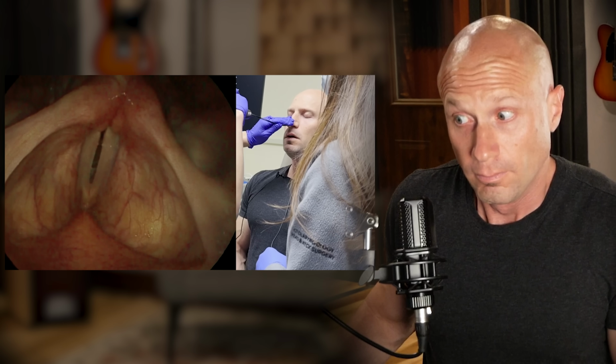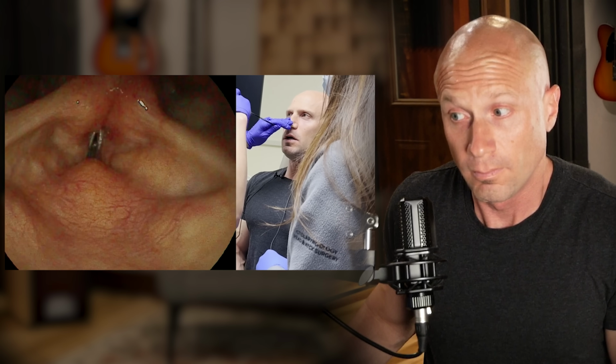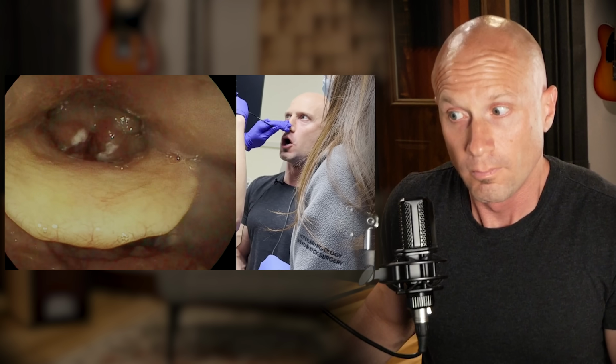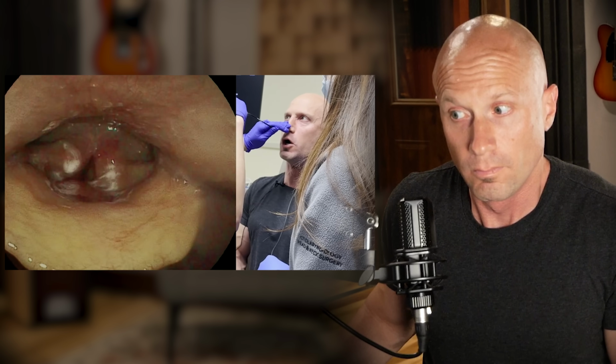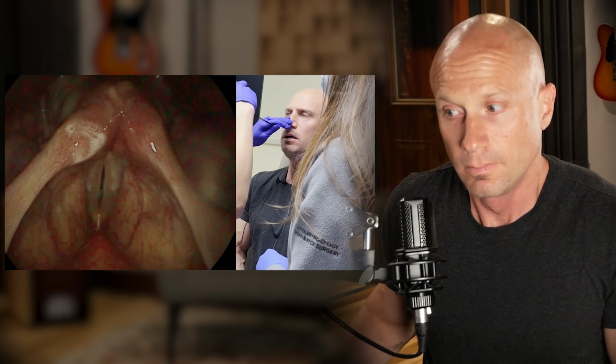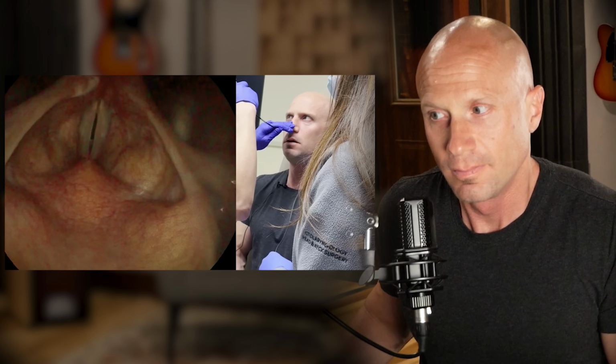I'm going from that, which does feel lower, and then shaping it, of course, with my mouth. That's what we're seeing here. And you can see foam from all the rattling of the fluid that goes on there as well.